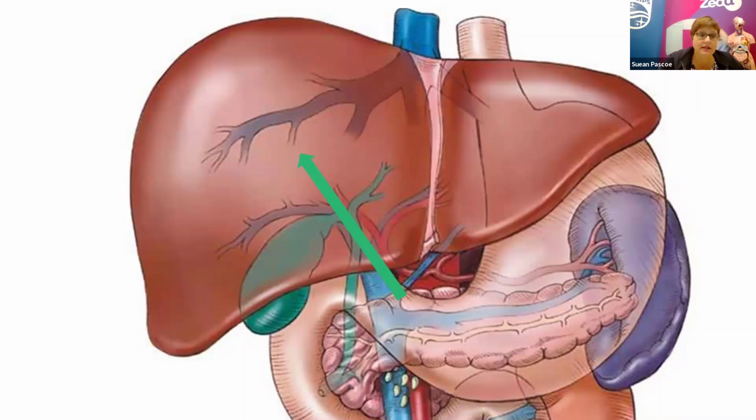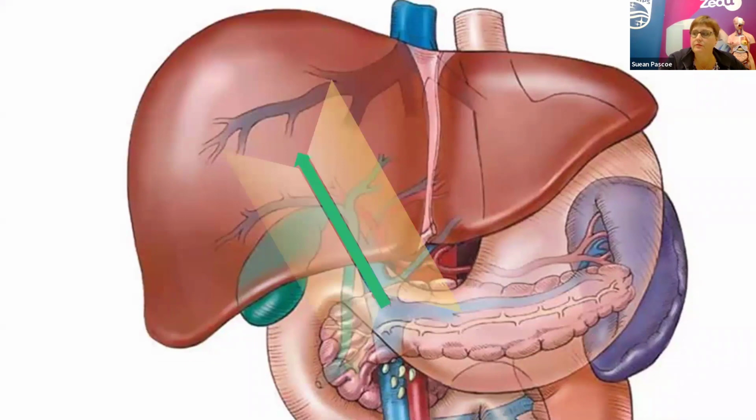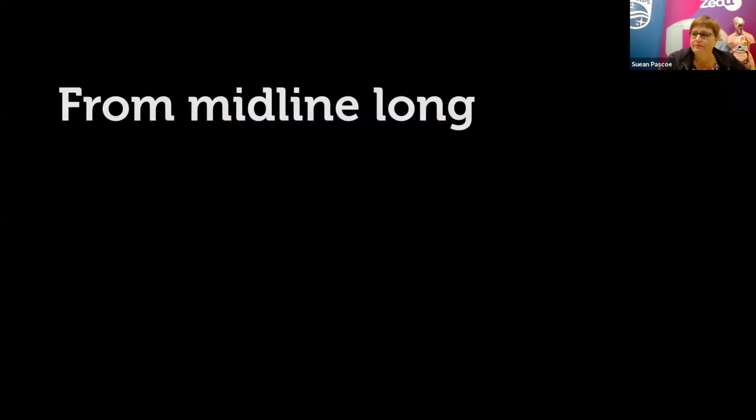Sometimes you can see it in exactly the same view. If you just lengthen out the portal vein, you'll see the common bile duct draped over the artery, but often you might need to just tilt the probe up and down ever so slightly. So we're tilting each way just a little bit.